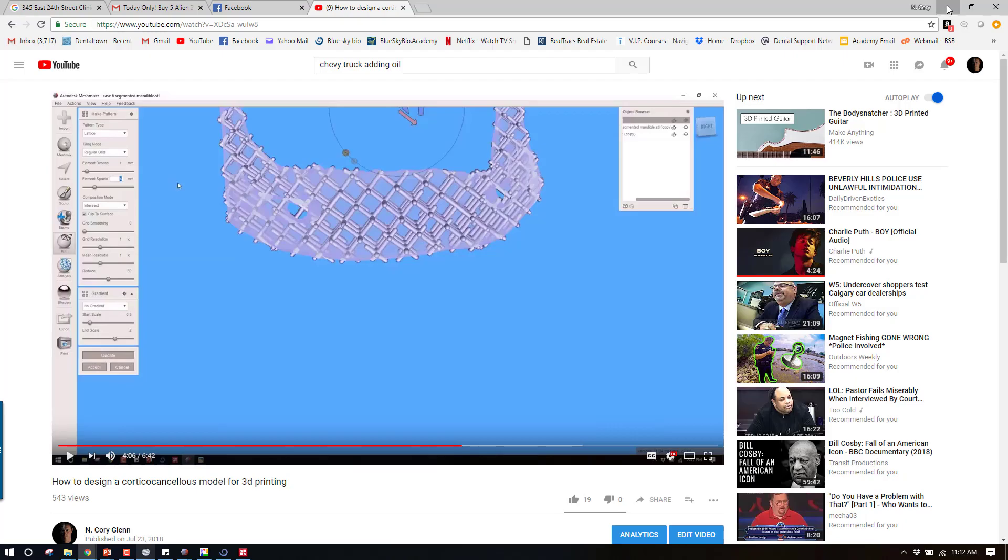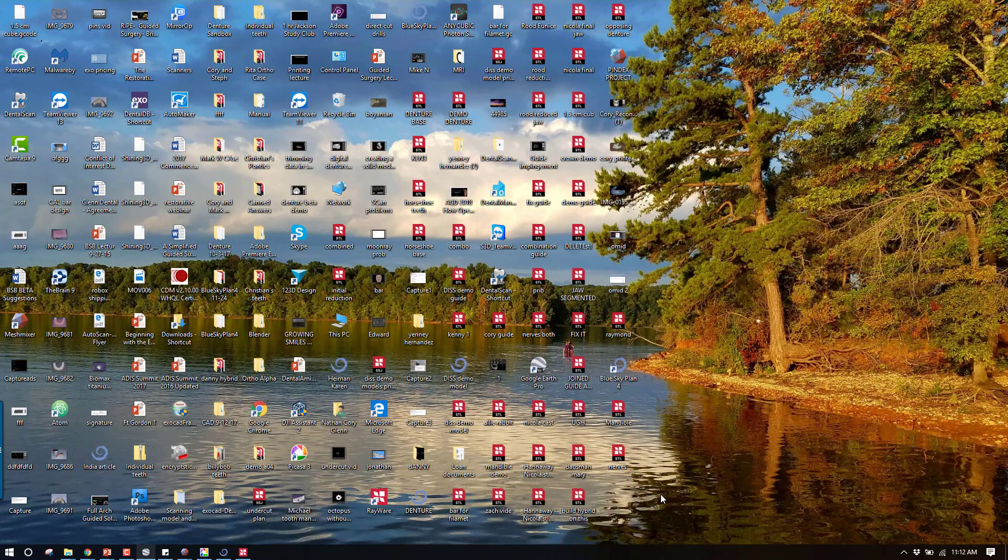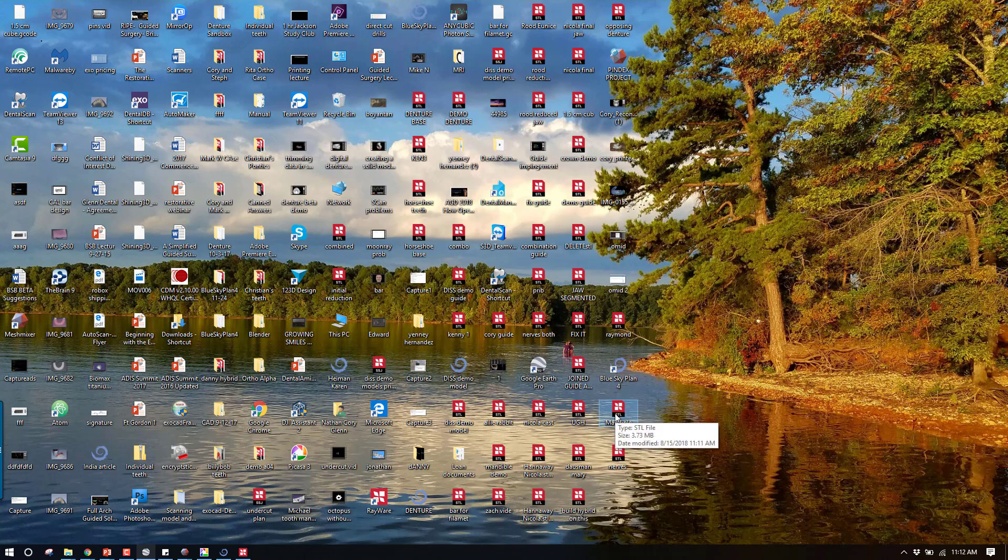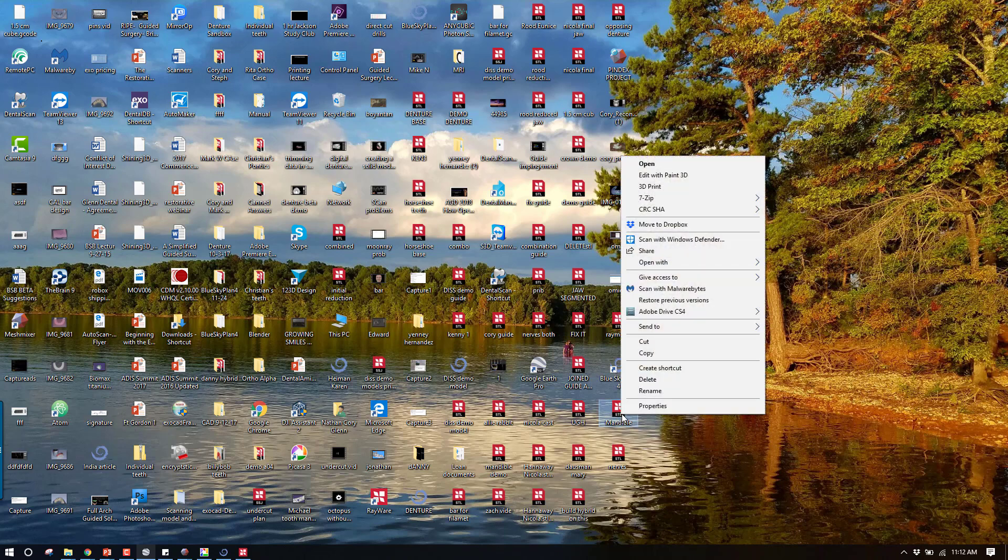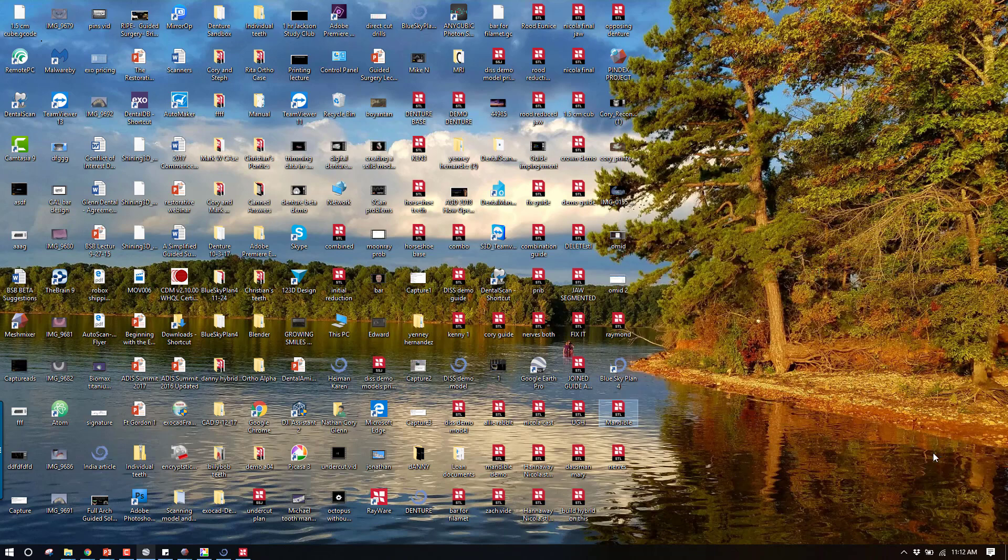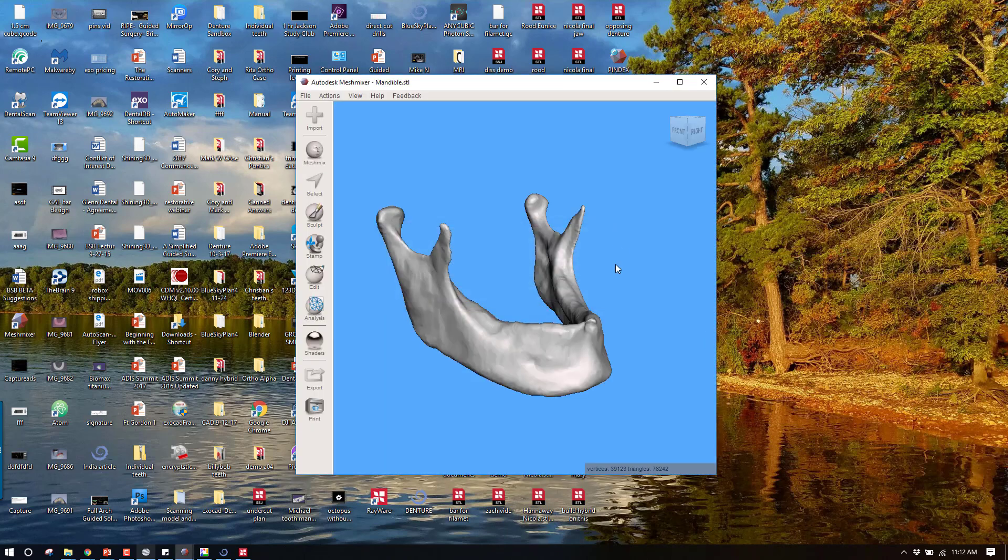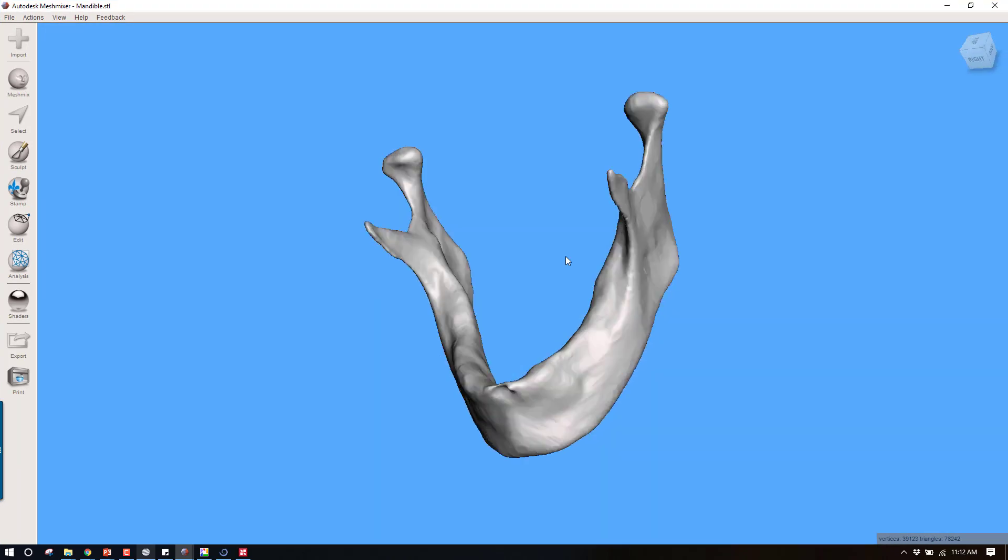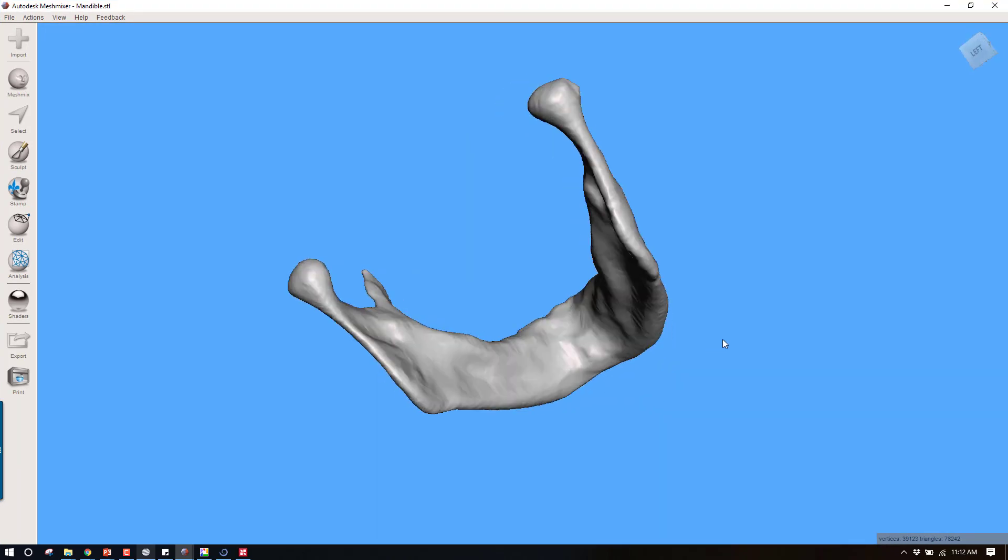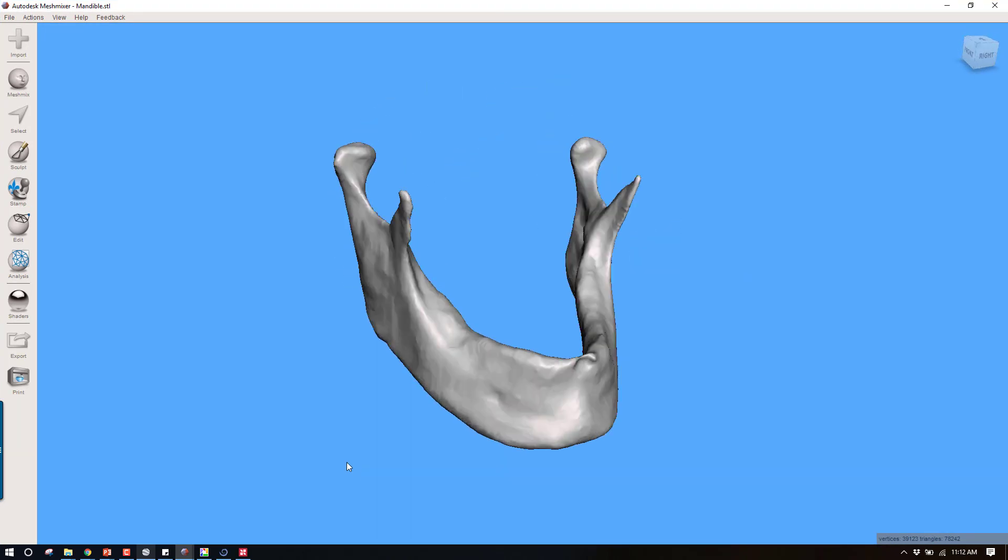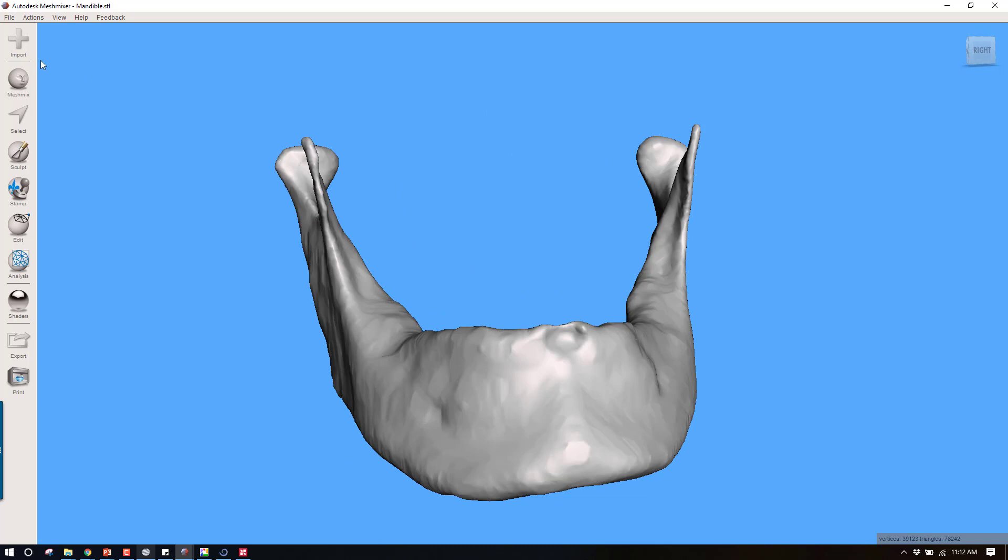I can minimize this. Let's find these files. I'm going to click this. Oops, wrong program. Give me just a second, I'll go into the right program, Mesh Mixer. Here we go. Maximize this window. You can see we have a mandible here. It's just a solid mandible though right now.